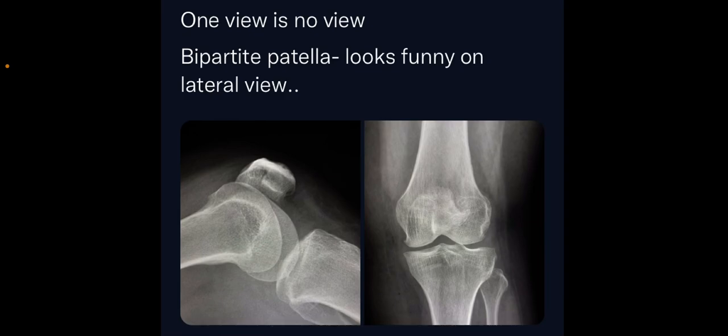Another classic example is bipartite patella. If you take a lateral view alone, you might miss this finding. On the left image, the patella looks grossly normal. On the AP view of the knee joint, you can clearly see the superolateral bony fragment with a clear lucency separating it from the entire patella. This is a classic case of bipartite patella, which is not usually appreciable on the lateral view alone.